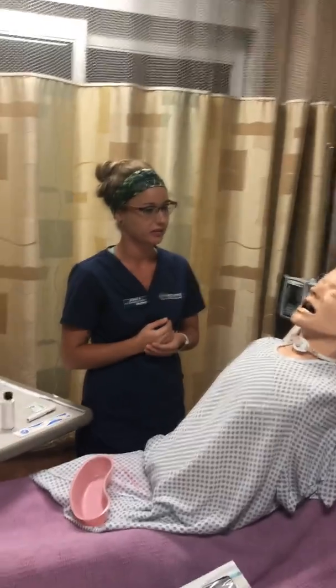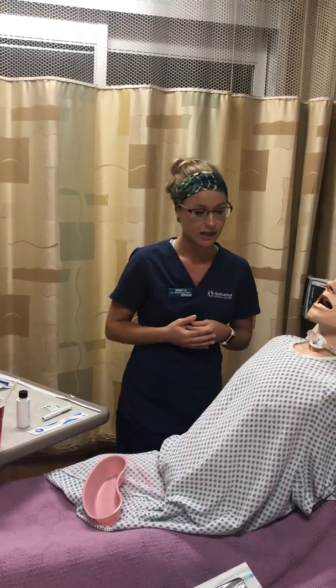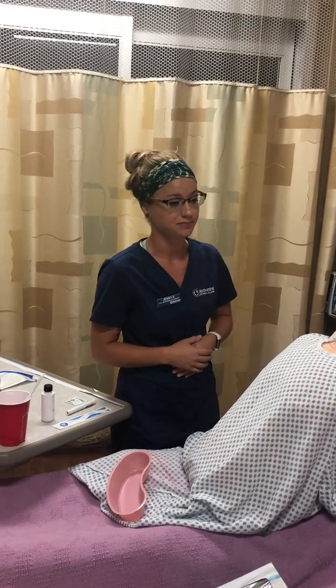So Jennifer, I just want to ask you a couple questions. First is, do you have a deviated septum? And she says no, she does not. Have you had any trauma to your nose at all before? She says no, she has not.